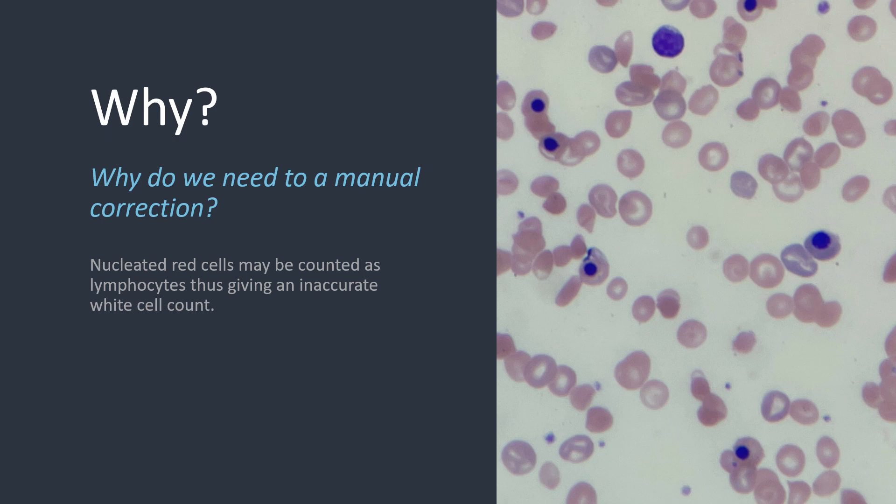So manual correction needs to be done to ensure the differential count is only containing the cells that we want, the white cells, and not any other cells.